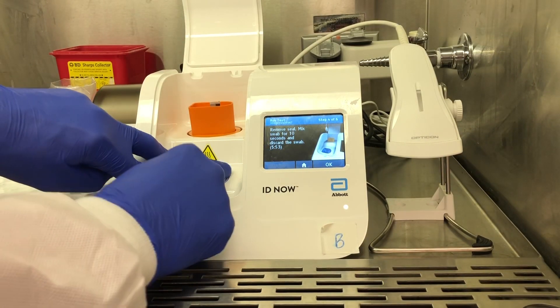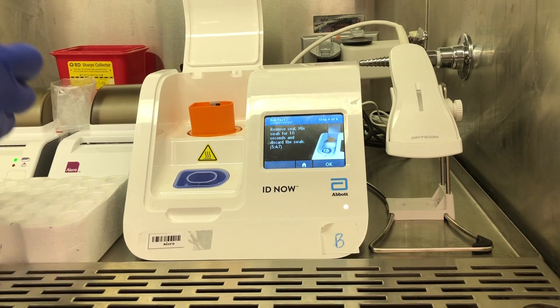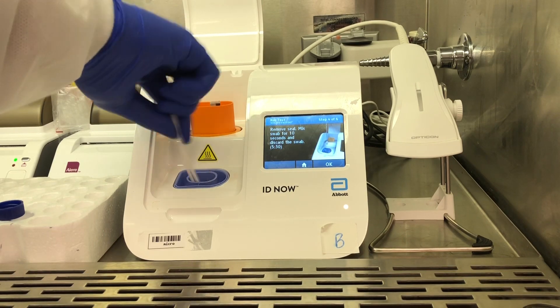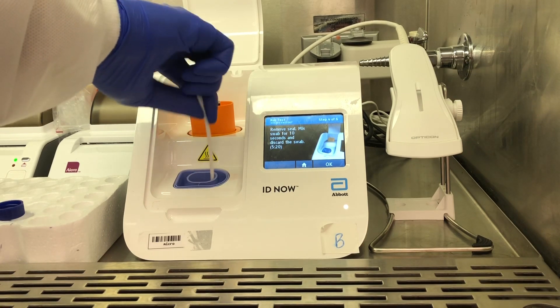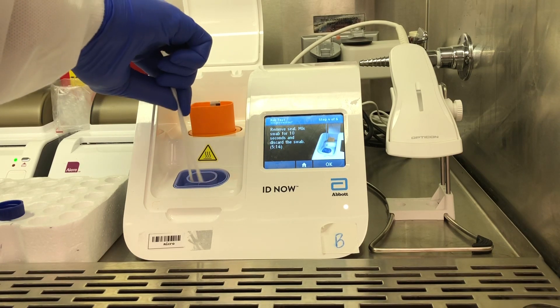Once your incubation is complete, you'll go ahead and remove the tab on top of the sample receiver, and you'll take out your swabs and mix them in the sample receiver for 10 seconds, which is what they recommend. I've been going a little bit longer — I try to double it and do 20 seconds to make sure I get as much material off of the swabs as possible. There have been some concerns with sensitivity on this specific test by Abbott, so the extra 10 seconds will help get as much viral RNA, if present, off of the swabs as possible.